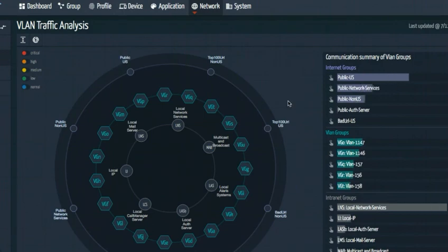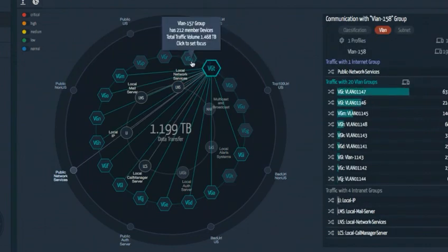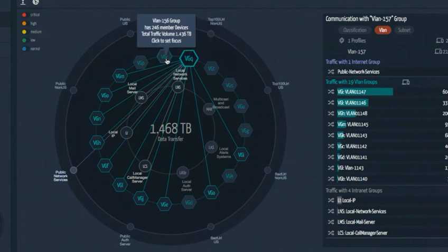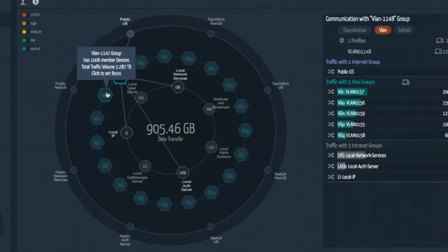In this case, I'm calling out what we call a constellation view, where all of the assets we've identified are placed in the different VLANs in your environment. VLANs tend to be one of the areas of the network where you put devices. So when they plug in to a switch port or connect via wireless, they get assigned a certain VLAN in your network. And we're tracking all the VLANs in your environment because we learn them automatically.